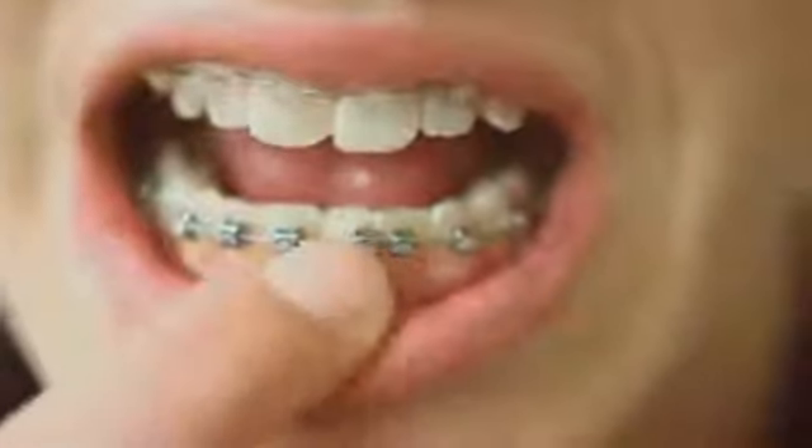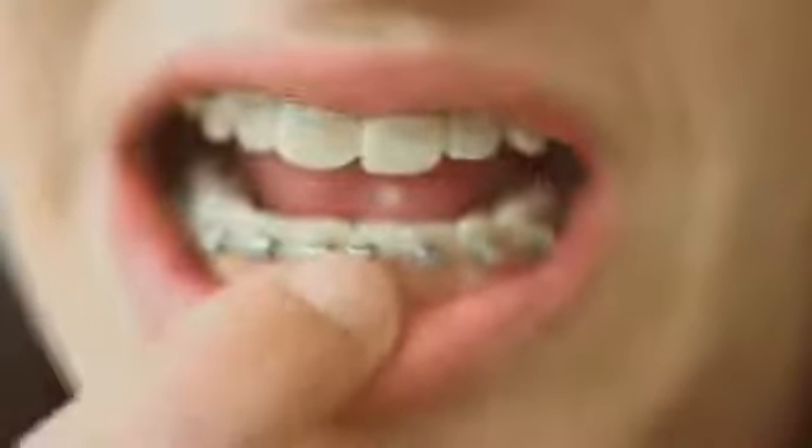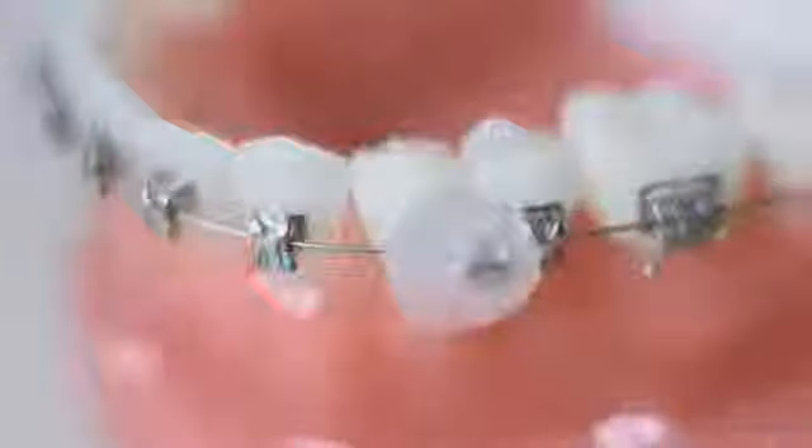If your bracket gets loose, first take note. If the bracket had a wire running through it, call to see if it needs to be reattached at this point in your treatment. If you have a loose bracket on a wire, simply dry the area and cover with wax. Then call to set up a rebonding appointment.